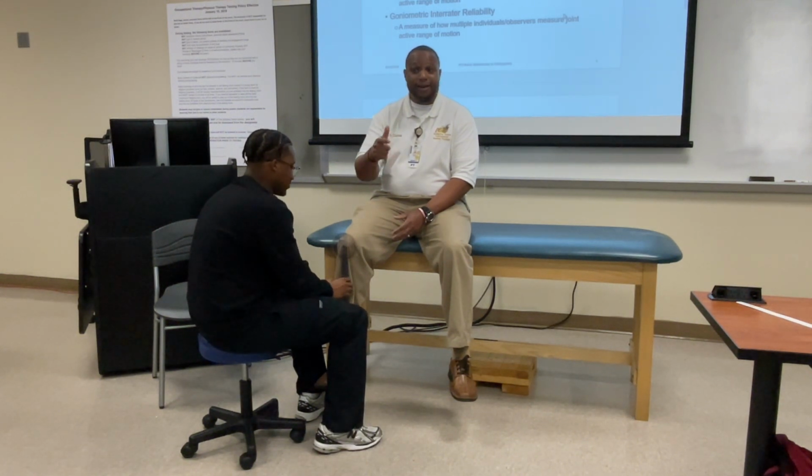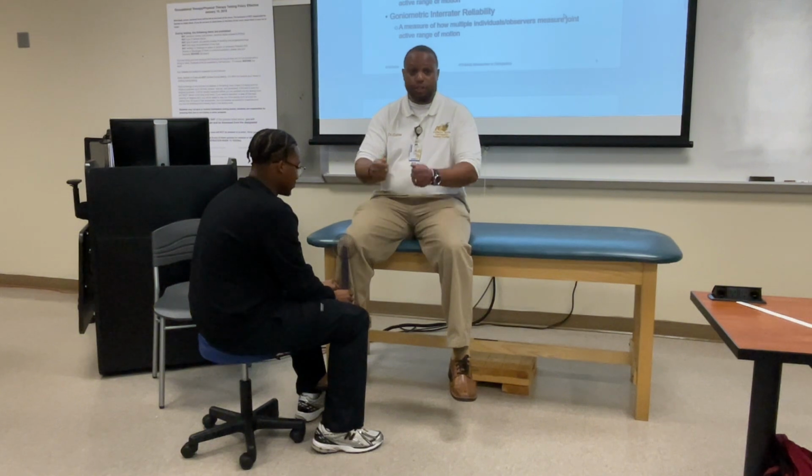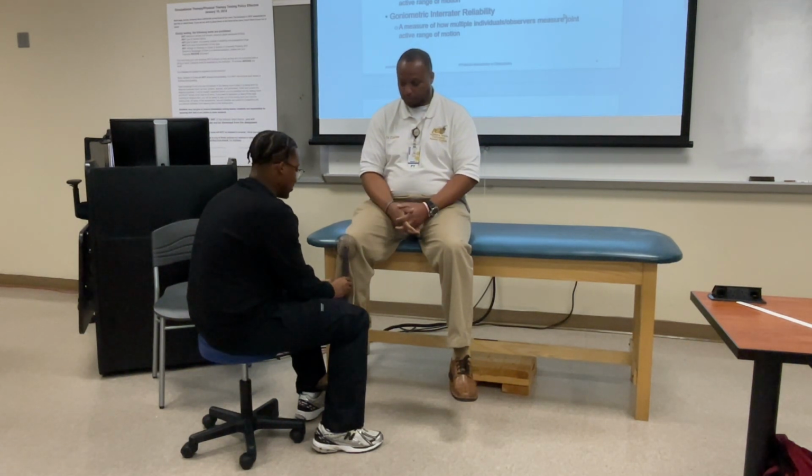Dr. McClure and I are coming to look to see if you keep your stationary arm still. All right. When you read your recording, make sure you keep your goni in place. Don't pull it away. Because if you pull it away, what's going to happen? There's going to be some minute movement. There's going to be some movement that occurs. You can do that motion one more time.